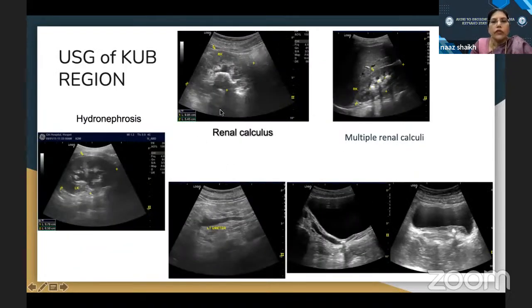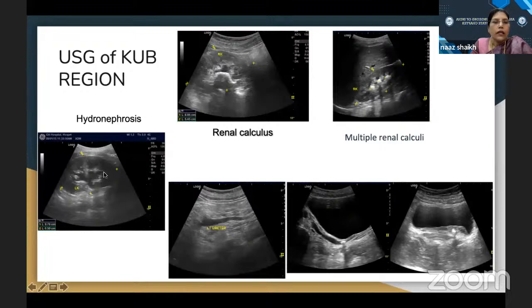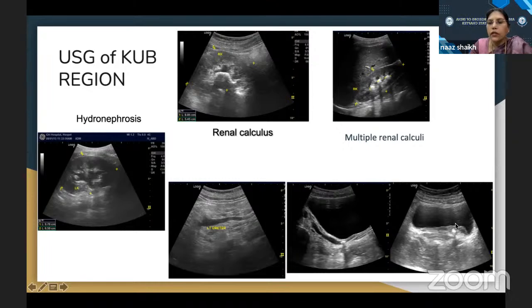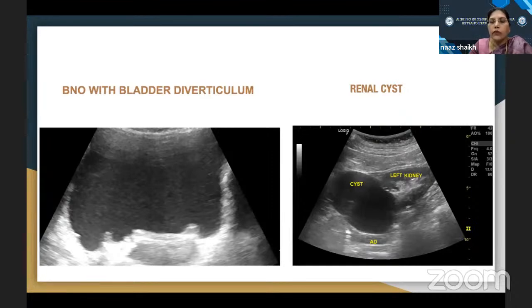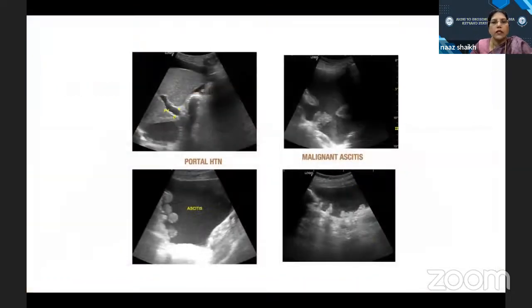The pancreas may be studded with calculi in the duct, with calcification in the pancreatic head, a hugely dilated pancreatic duct, and large pancreatic pseudocyst. The KUB region gives very good images: large calculus in the renal pelvis, multiple calculi in the kidney, and hydronephrosis — trace it down to find the calculus at the vesicoureteric junction. If you see edema around a stone, probably it is not going to pass and would require ureteroscopy. You can also identify bladder neck obstruction with multiple diverticula, large renal cysts, simple ascites, portal vein with ascites showing bowel loops floating, and malignant ascites with deposits on the ovaries and peritoneal deposits.